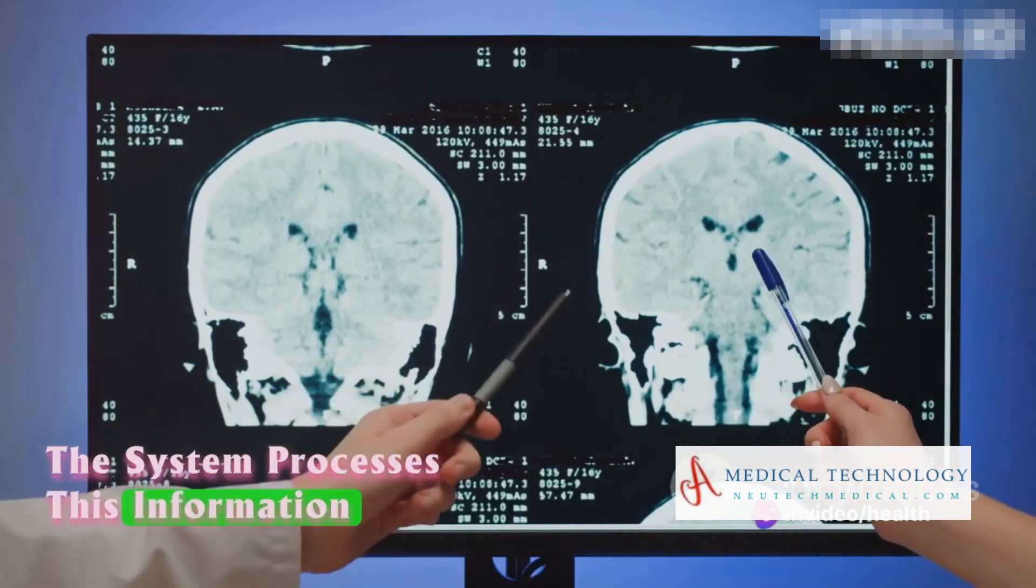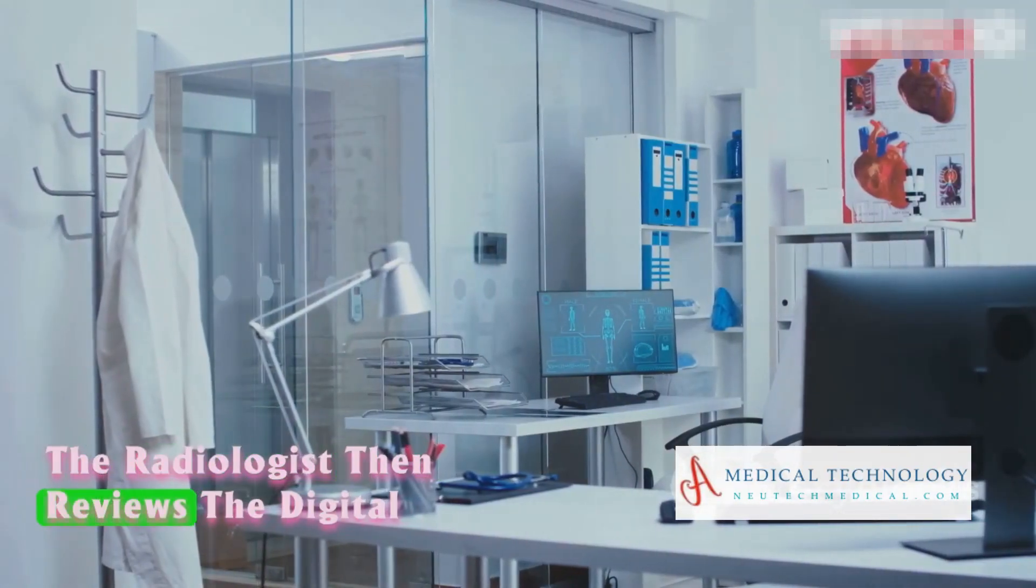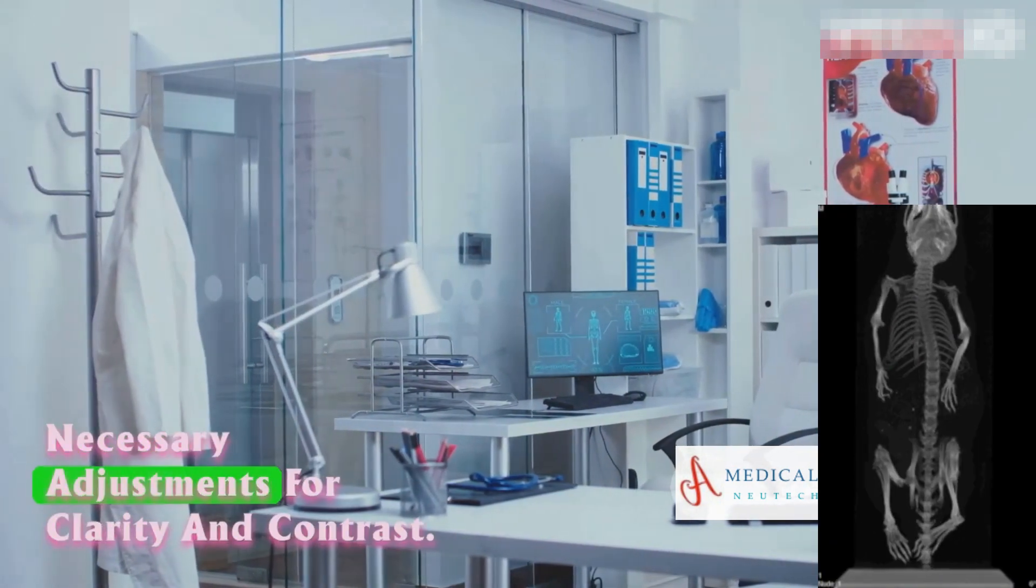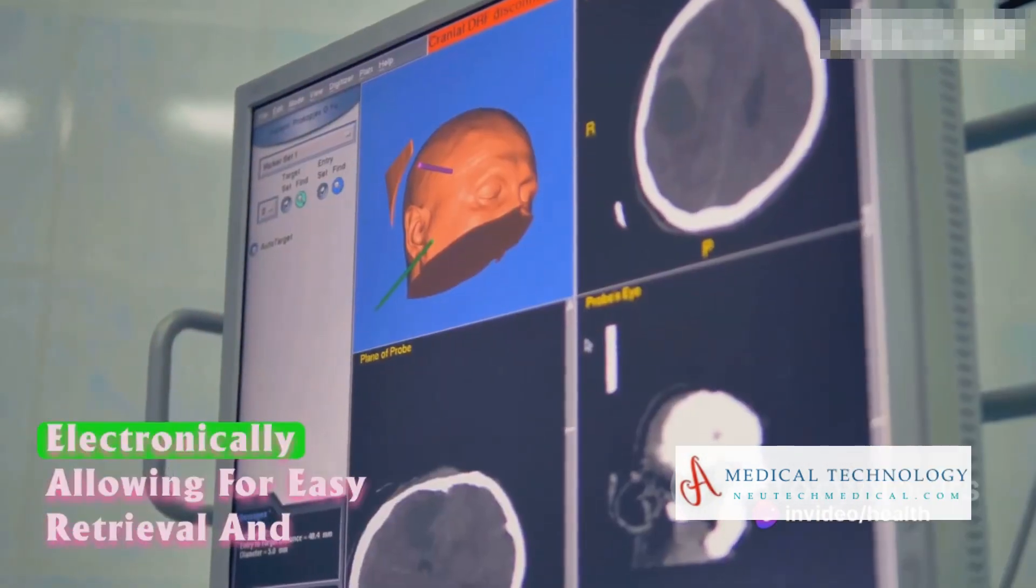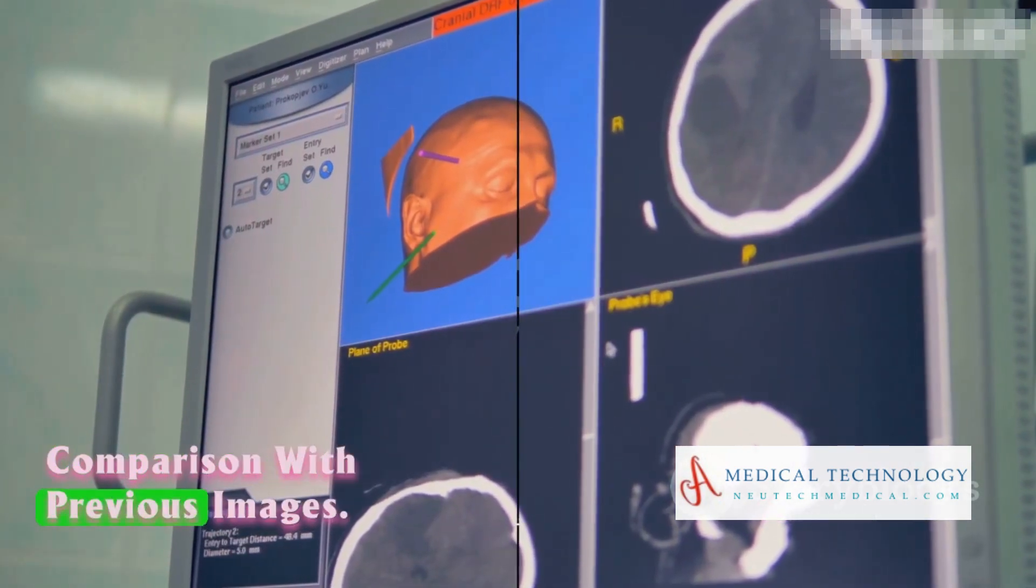The system processes this information to create a digital image. The radiologist then reviews the digital image on a computer monitor, making necessary adjustments for clarity and contrast. Lastly, the digital image is stored electronically, allowing for easy retrieval and comparison with previous images.